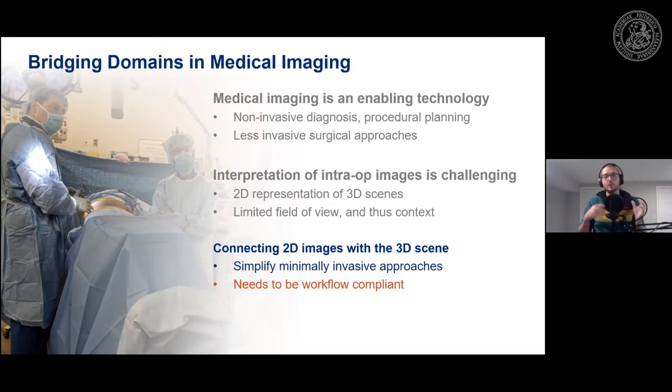Now, a lot of those approaches are in the context of surgical navigation, where we put markers all across the scene and use optical tracking systems that allow us to register all these components. The problem with those systems is that while they accomplish this task quite efficiently, they also come with increased workflow, increased calibration times at the end. And overall, they are not particularly compliant to the current surgical workflow, which inhibits their adoption.